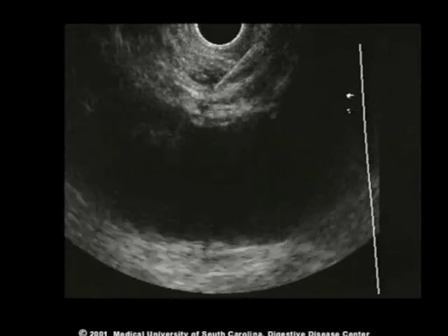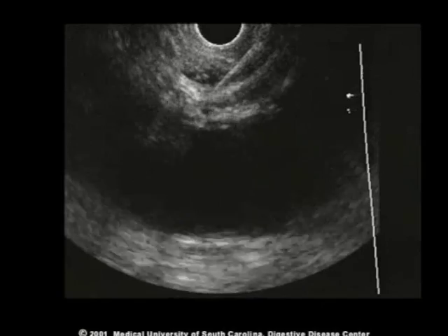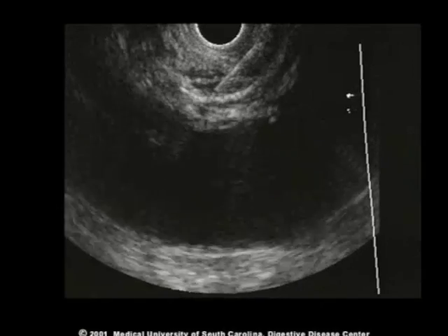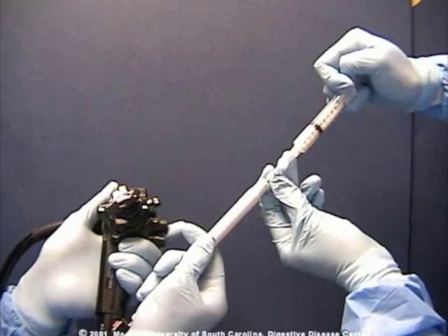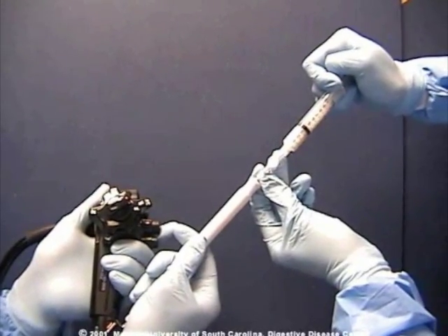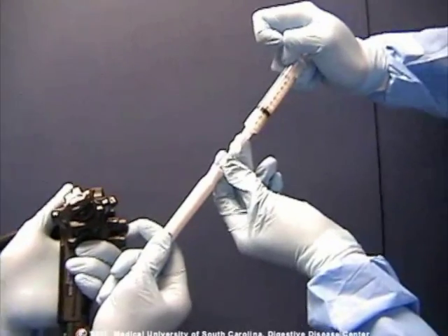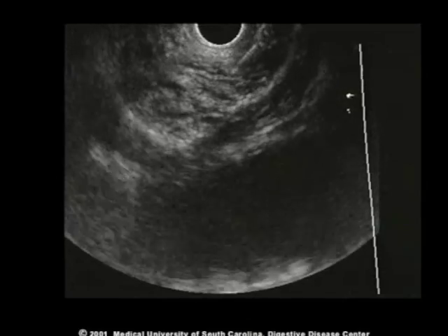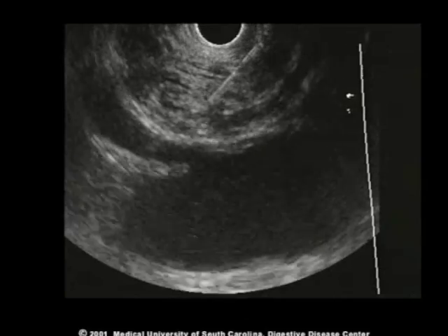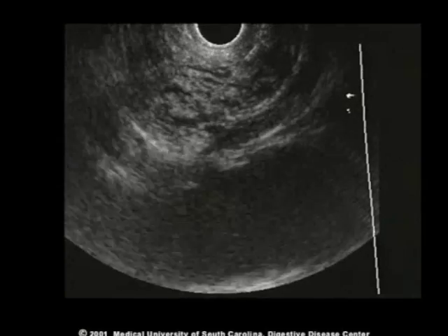During the injection, it often requires considerable pressure to inject the material, since the fluid is entering the soft tissue space. On most but not all occasions, fluid can be seen entering from the tip of the needle and forming a small track or well of fluid near the celiac artery.